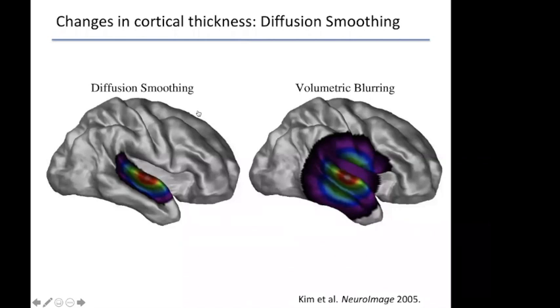So in volumetric studies, for example in a VBM study or in a lot of fMRI studies, where you're not using surface-based models, you'll use a volumetric blur, which basically means the weighting of the average drops off as a function of a Gaussian kernel, and you weight the stuff at one point higher than you weight the stuff that's in the region.